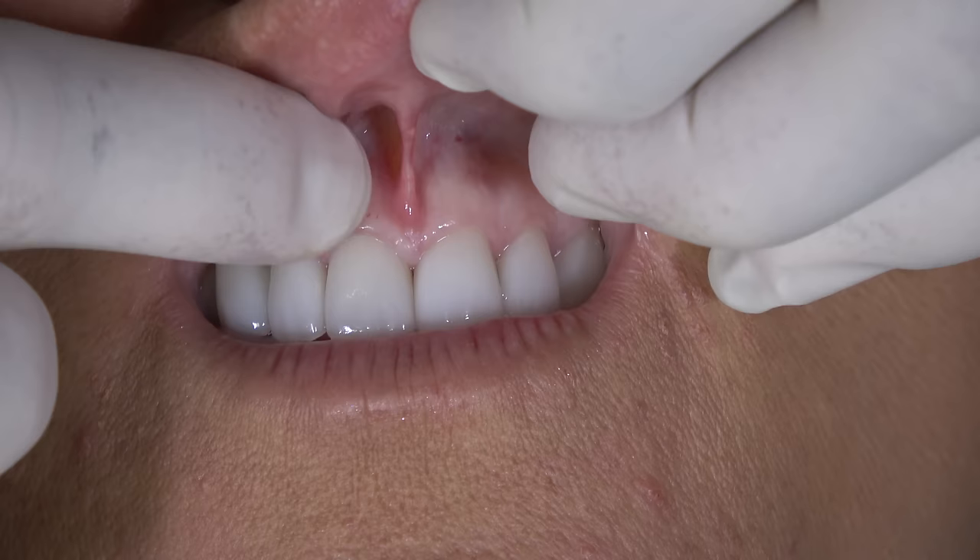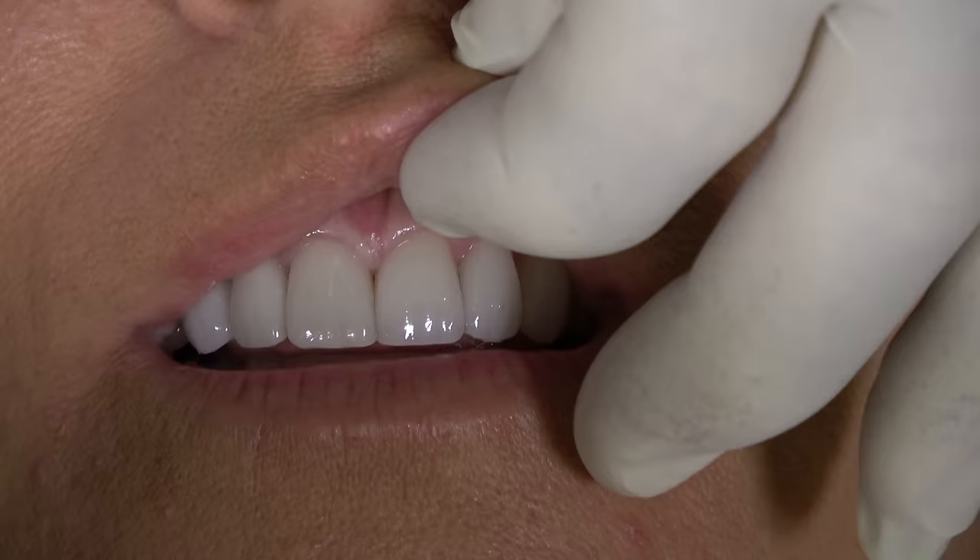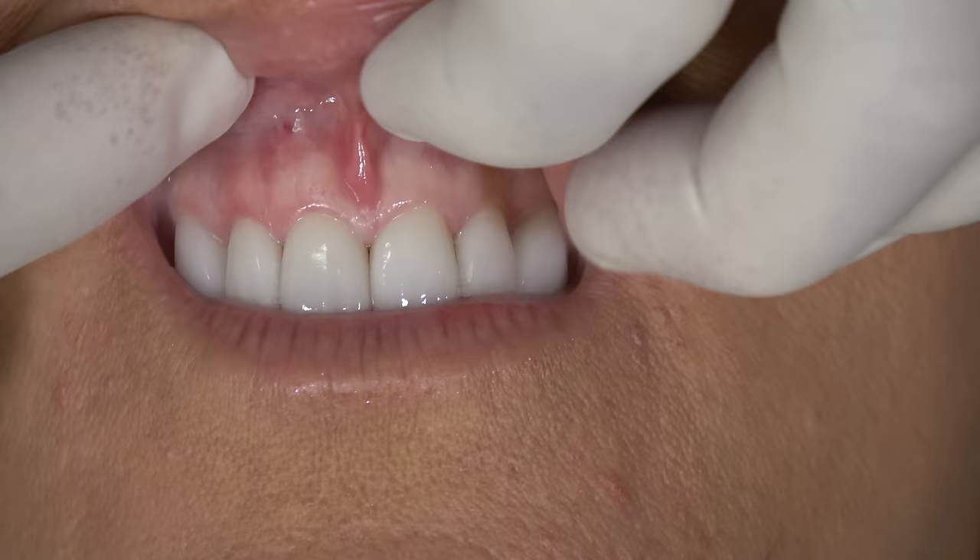We want to bring it up so she'll actually have a fuller upper lip when we're done. Also with the attachment of the frenum right near the papilla between teeth 8 and 9, we can actually close this gingival embrasure slightly because we eliminated those fibers from pulling every time she smiles.